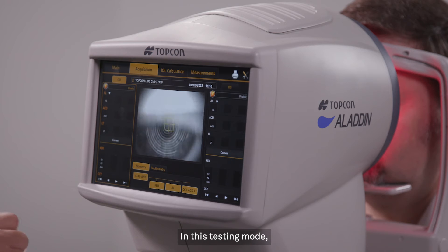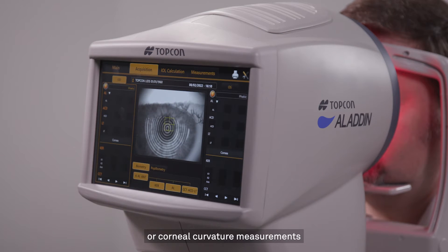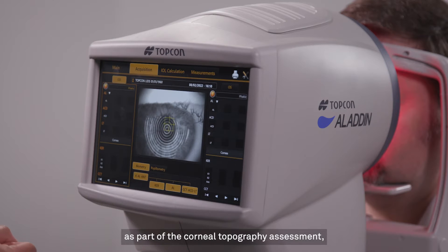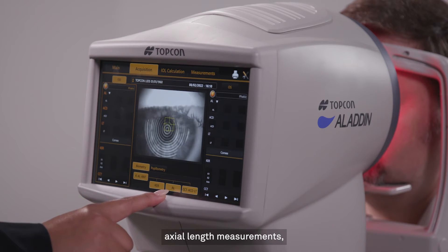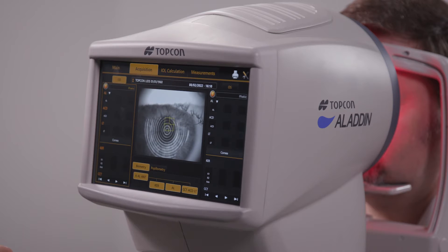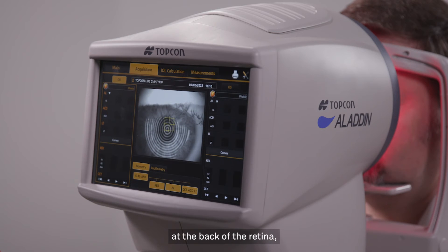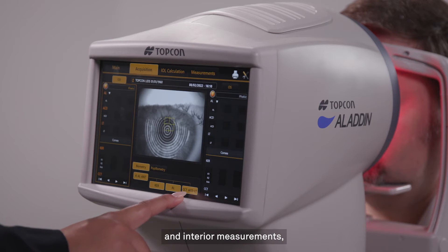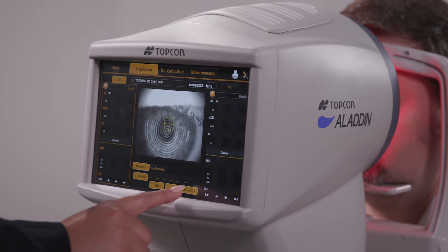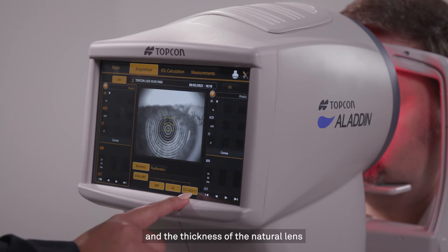In this testing mode, the Aladdin will acquire keratometry, or corneal curvature, measurements as part of the corneal topography assessment, axial length measurements — which is the distance from the front surface of the cornea to the retinal pigment epithelium layer at the back of the retina — and anterior measurements, which include the central corneal thickness, the depth of the anterior chamber, and the thickness of the natural lens of the eye.